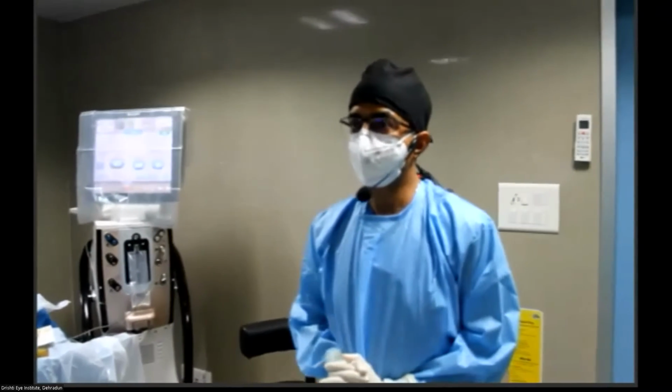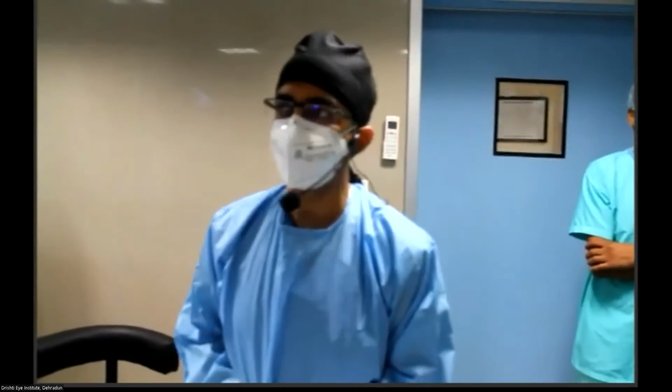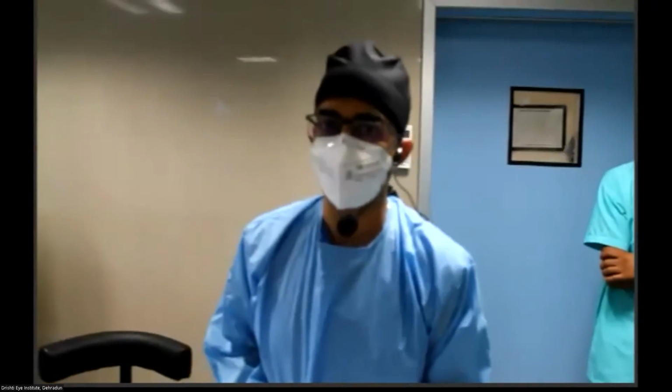And Dr. Abhijat will take you through the cases that we have today. The first one is for the intravitreal aflibercept.